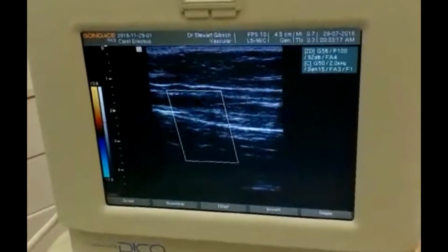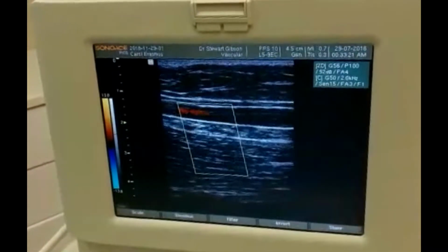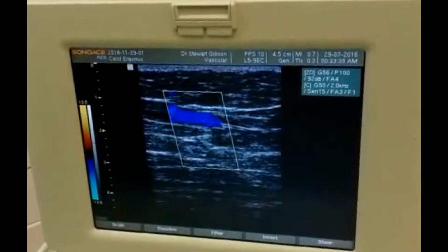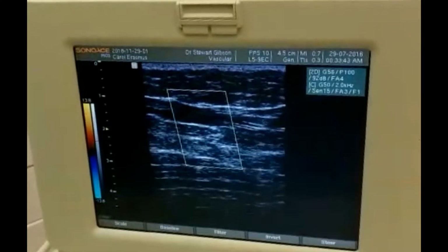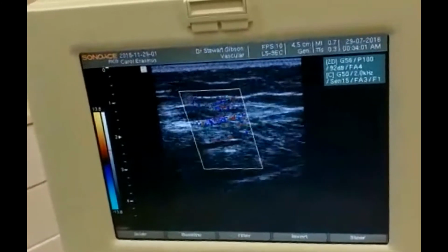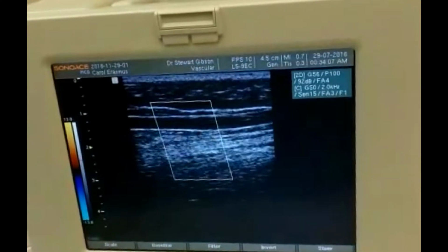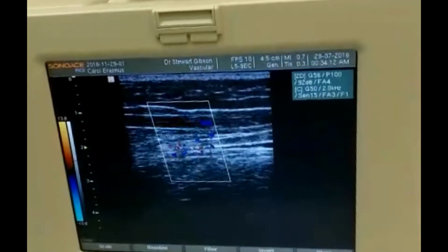We're now in the Hunterian perforator area. Just to prove that this is the great saphenous vein, we're going to use some pressure, and we'll notice that there's definitely reflux, as you'd expect with a varicose vein history. The high venous return has stopped below the knee. Great saphenous vein clearly visible with reflux.